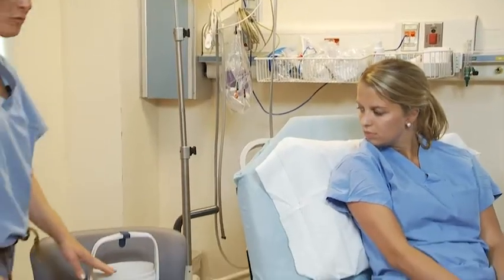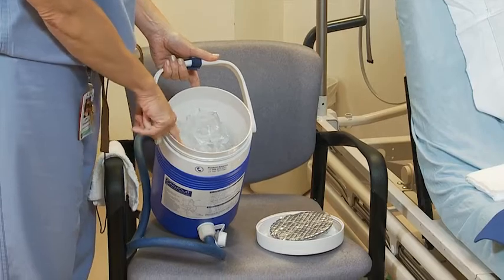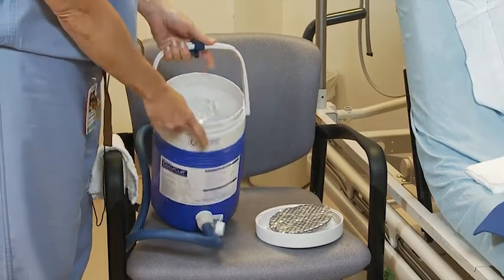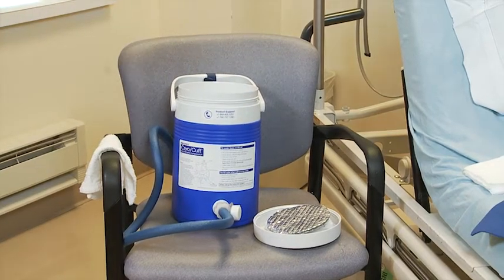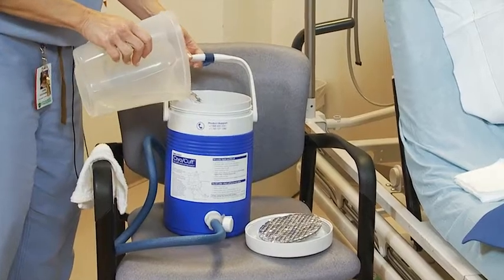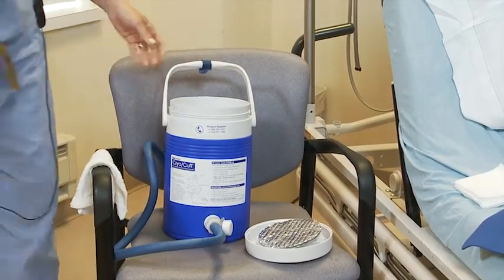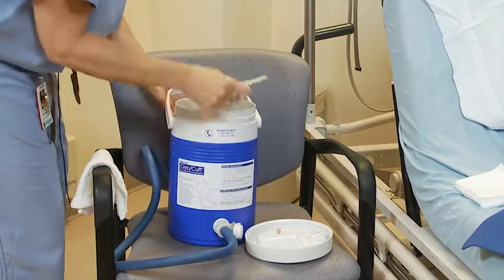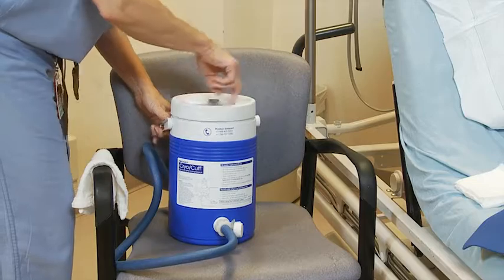This is the CryoCuff cooler. You're going to fill it first with ice to about the first level or four inches below the top. Then you take water and fill the cooler with water. You can take the silver insulating disc and put it on and then screw the top on firmly.